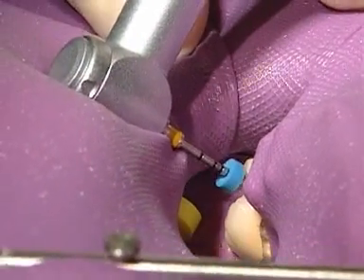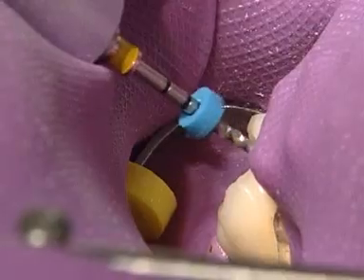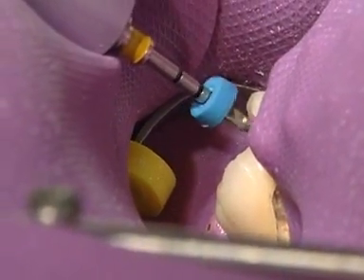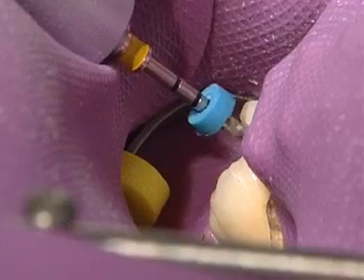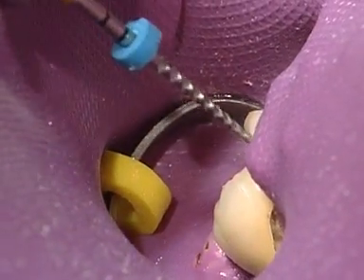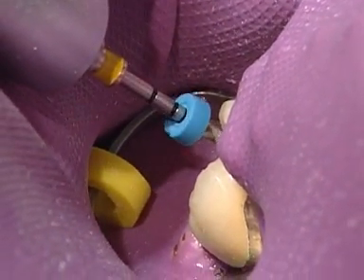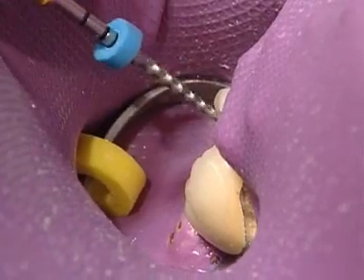Preparation is continued with the 0620. With the auto-stop reverse function, the unit automatically rotates in reverse direction when the programmed torque limit is reached. If a file is blocked, it oscillates between forward and reverse rotation until the file is released, an additional measure against instrument fracture.